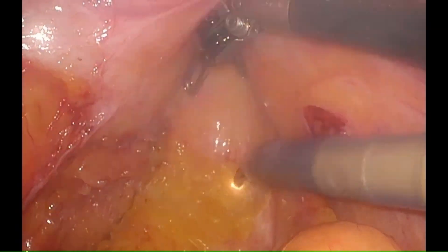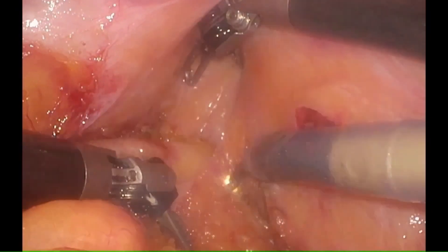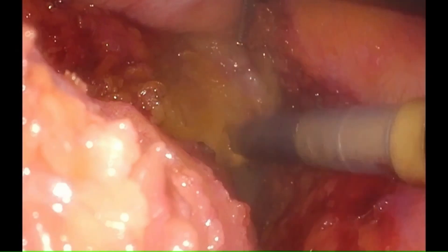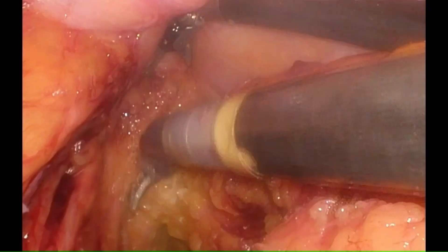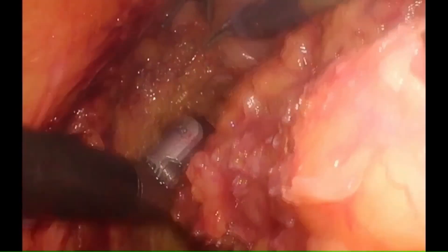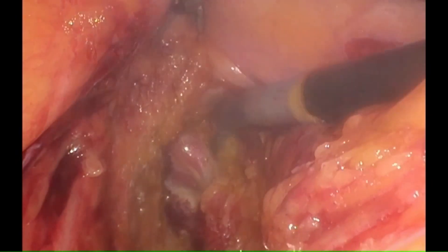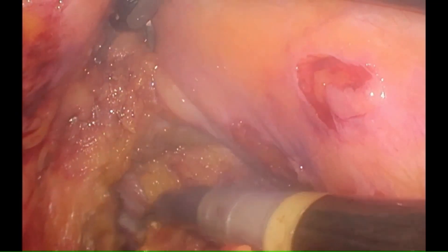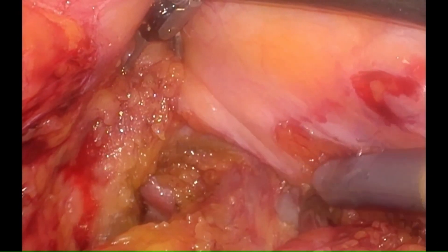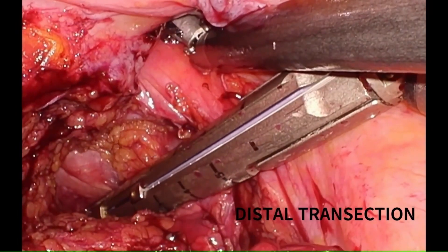Lastly, anterior dissection is done in between the two layers of Denonvilliers' fascia. We continue our dissection beyond the TME to expose the bared rectal tube. Enlarged magnified vision and the endurance of the robotic arms allows us to dissect up to the pelvic floor and expose the levator ani muscle. We do the distal transection using an endo-GIA stapler passed from the assistant port.